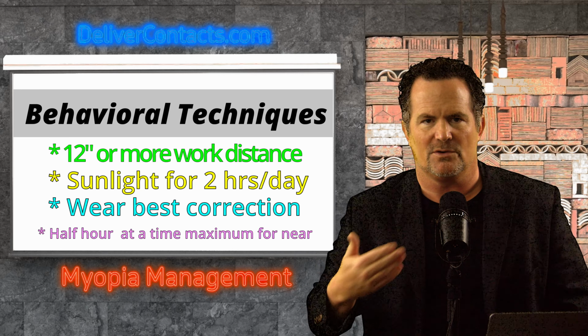So it concentrates on that fovea to make sure that the kid can see well, but then the parts of the eye that the kid's not paying attention to, the peripheral, it's actually working on that so that the retina in the brain that sees it will stop that eye from growing, and that has proven itself, like I said, as about 50% decrease in the growth of the eye. Okay, so that's a good one.